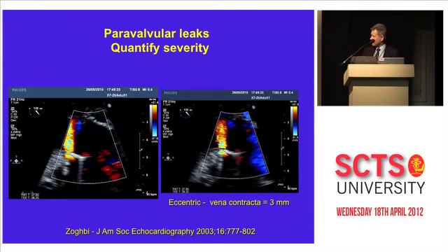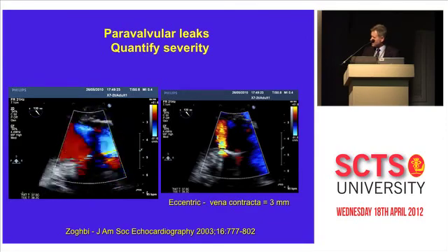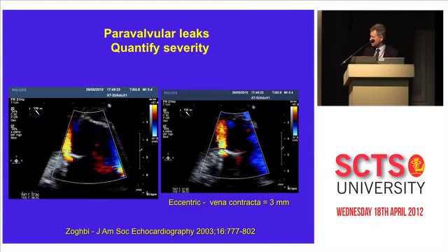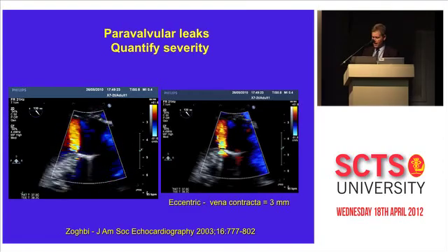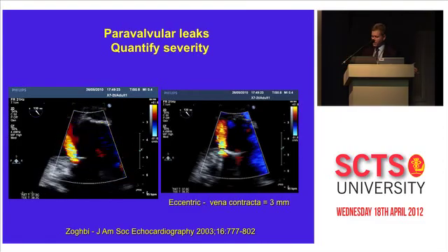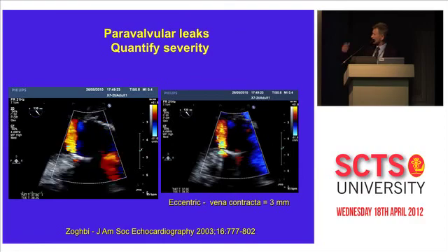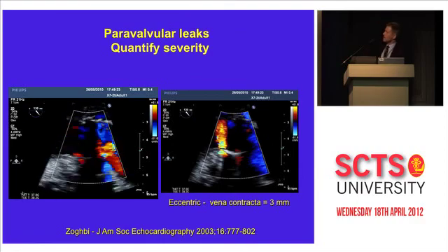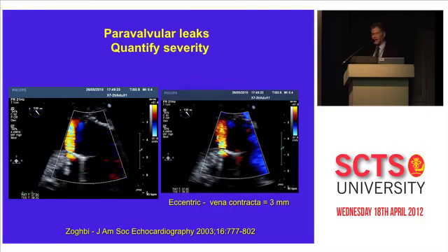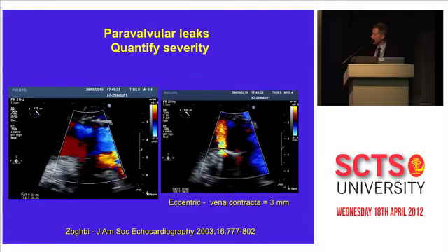But you cannot really give an opinion about the anterior side of this prosthesis. And again, in the short axis, the same. However, how severe is severe when you have a paravalvular leak, and shall we do something about it? Now, this is not a very severe paravalvular leak. However, there are a few characteristics there that I do not like when I see this type.